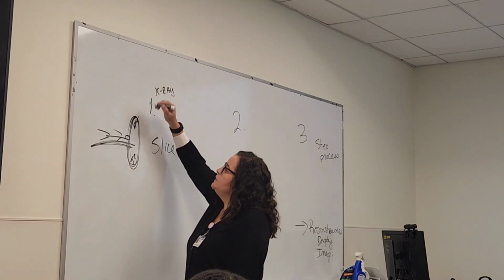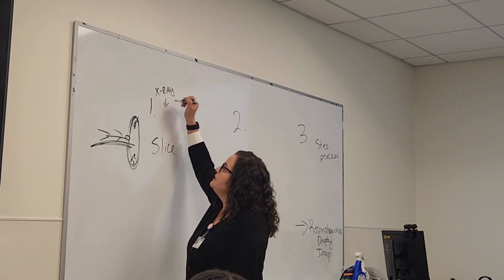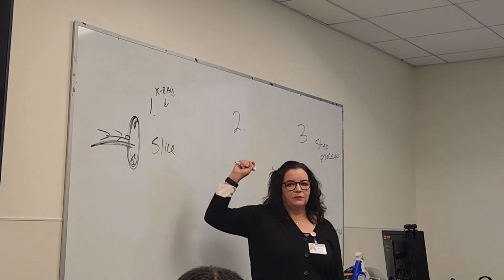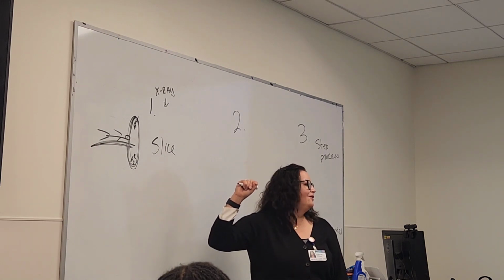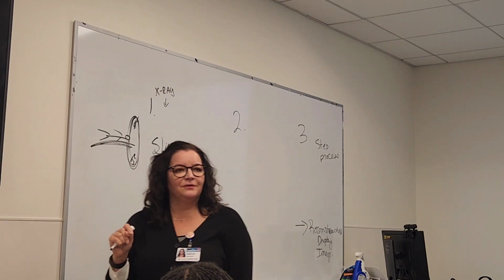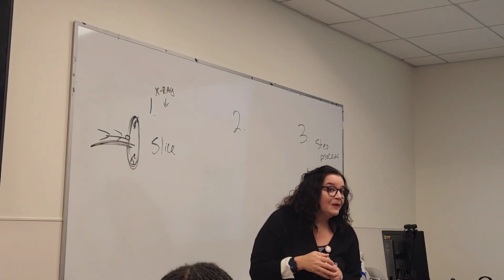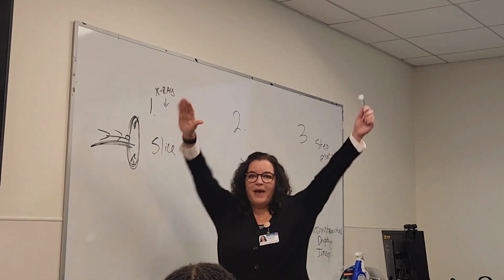We know that X-ray is going to emit, and we're going to get to the principles of X-rays, refresh our memories, but it has to get to what to make it an image? What does X-ray have to connect with? I promise you're like, oh, she's talking in riddles. What do you align the CR to? The detector? To the what? The image receptor. Perfect. You guys passed. You passed radiology.